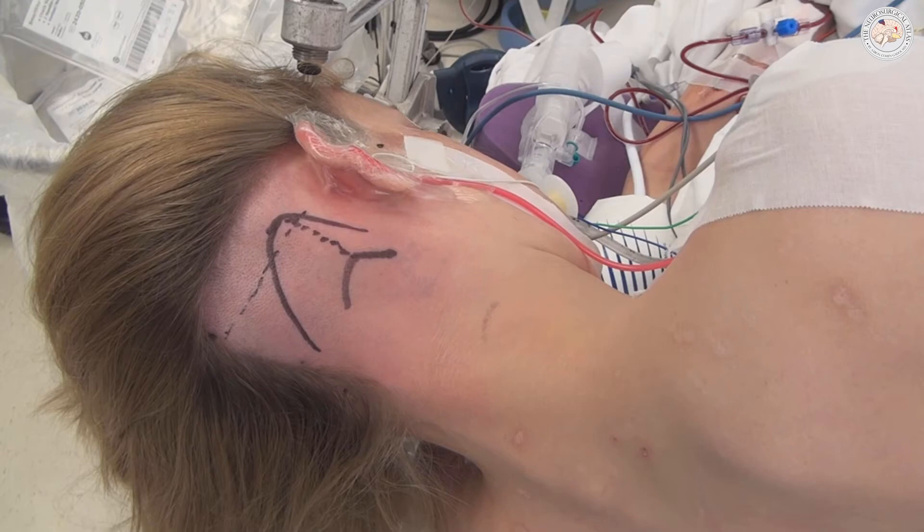Let's go ahead and review the nuances of technique for placement and planning of the curvilinear incision. I have also abandoned the use of the linear incision for retromastoid craniotomy.